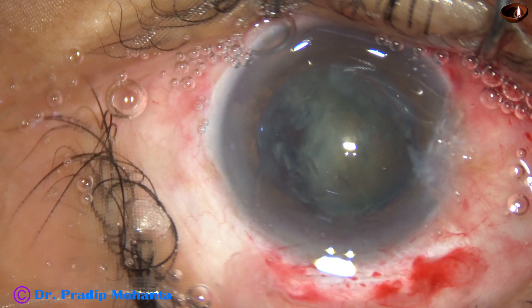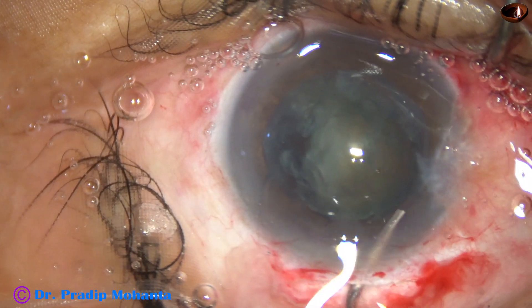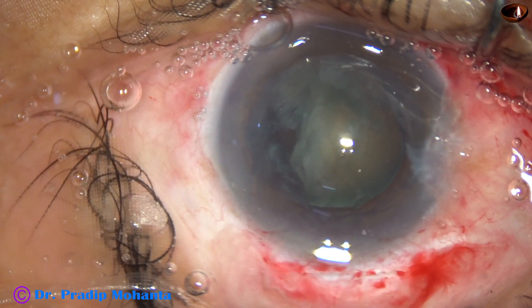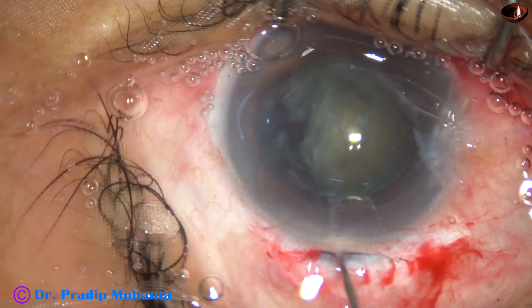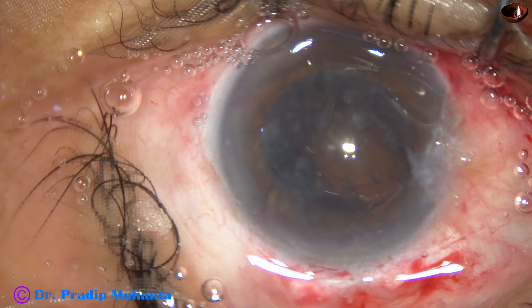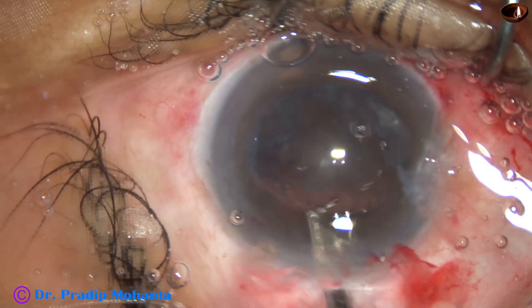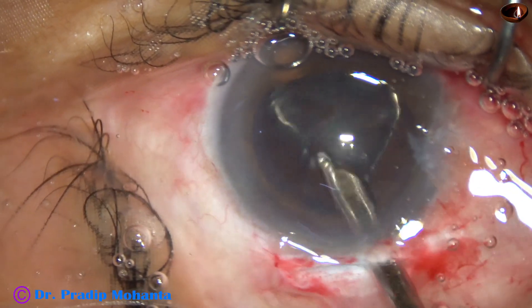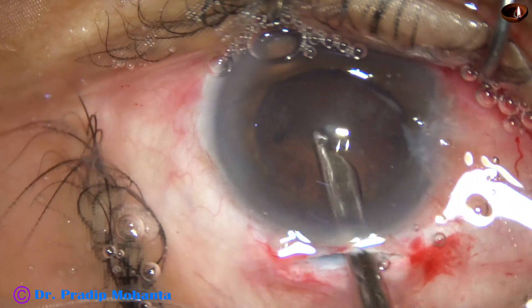Inject visco again all around this piece, and then use the fish hook again to bring out this heminucleus. Now cortical cleanup is done with the help of this Simcoe cannula.